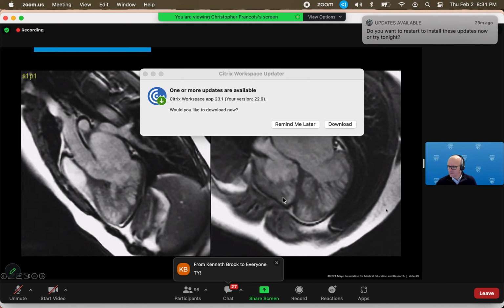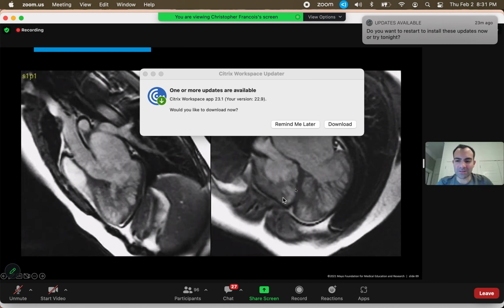Somebody had asked if it's an acceptable general rule to remember sarcoid delayed enhancement as subepicardial versus amyloid being subendocardial. Yeah, so sarcoidosis is frequently subepicardial in location. Amyloidosis on board exams, I think they'll say circumferential subendocardial or diffuse subendocardial. But frequently, in practice, you'll see it's just diffuse. It's everywhere.